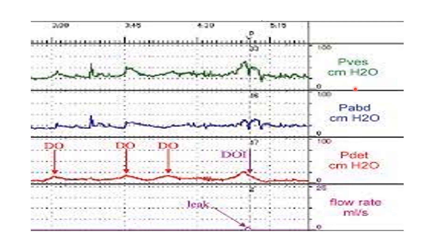In this next graph, looking at vesical and abdominal pressure, there is no significant rise in either. But the detrusor pressure line shows a slight rise during the filling phase. Simultaneously, there is leakage of urine. This is urge incontinence due to detrusor overactivity. Whenever you look at a urodynamic graph showing detrusor overactivity, you will always find a raised detrusor pressure, and simultaneously there will be a leak.